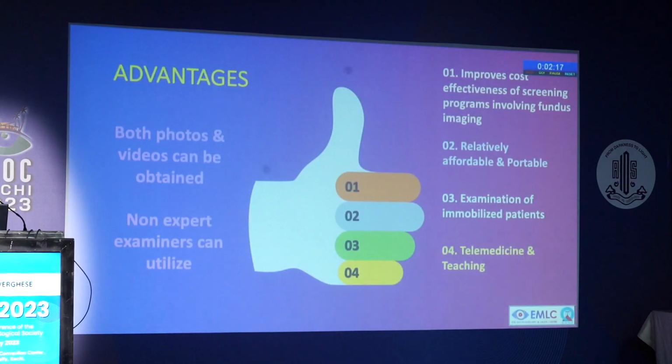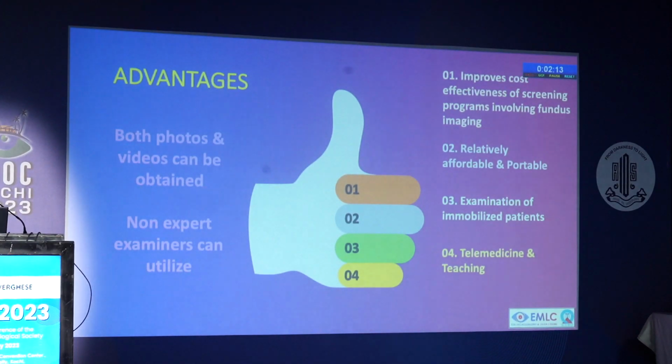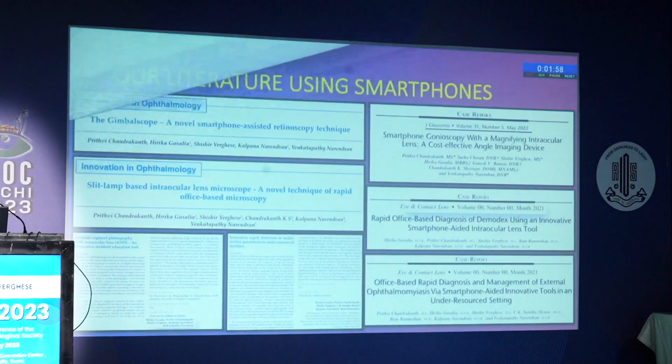The main advantages of the T3 RedCam are that non-expert examiners can utilize it easily, its affordability and portability, and improving the cost-effectiveness of screening programs. To conclude, both the imaging devices we mentioned are frugal, cost-effective, and can be used for screening, documentation, teaching, and patient education.